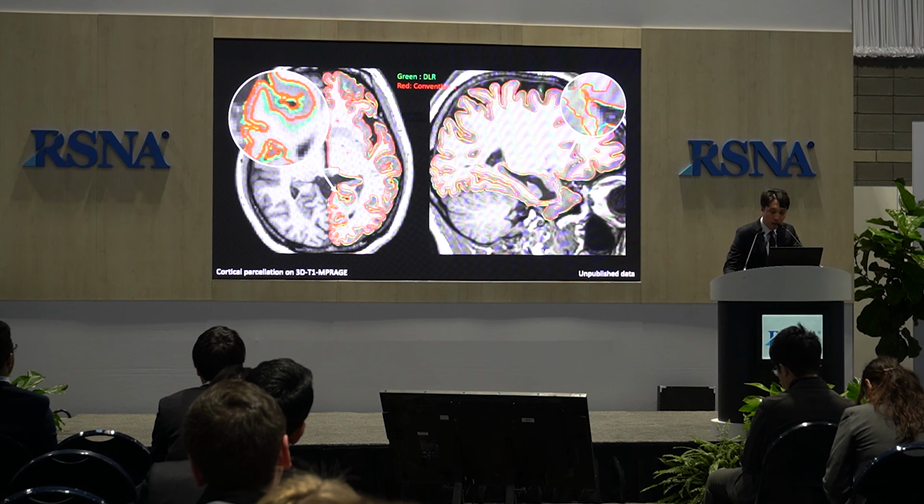Now it's interesting because these two scans are not taken in the same parameter settings. The conventional one has a distortion artifact in the frontal sinus area. After Swift MR reconstruction, with some parameter adjustment, there is a reduction of the noise in the frontal sinus.